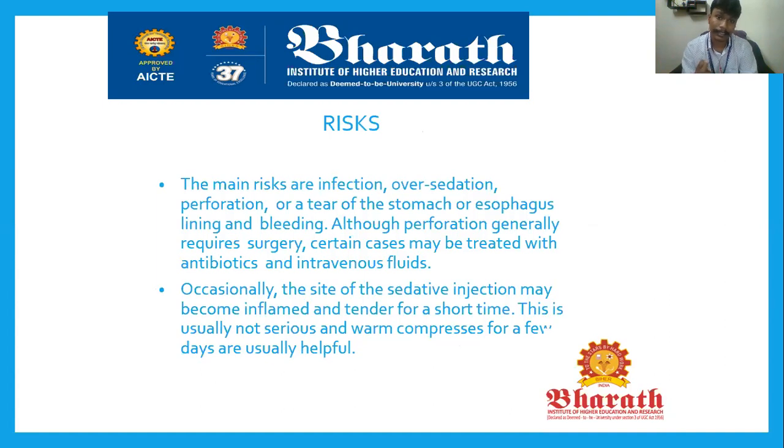We are inserting a fiber optic material into the human body, so it should be done in a very safe region or hygienic place. Infectious factors are more while performing the endoscopy process. So the main risks are infection and over sedation.